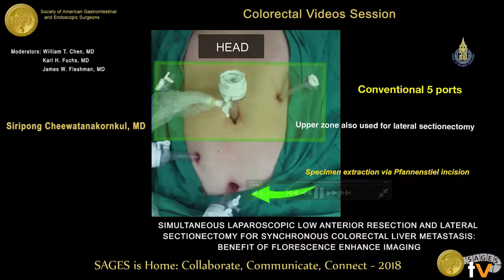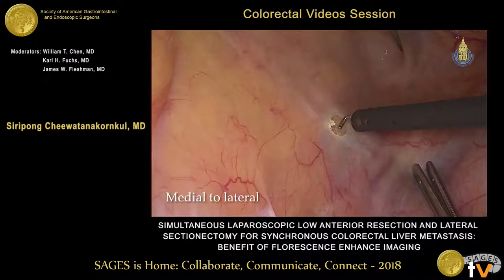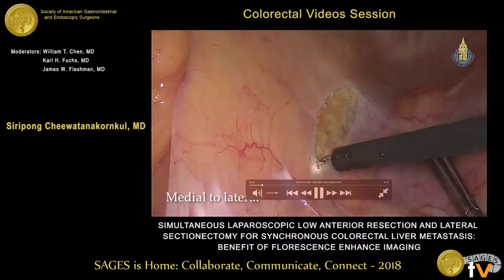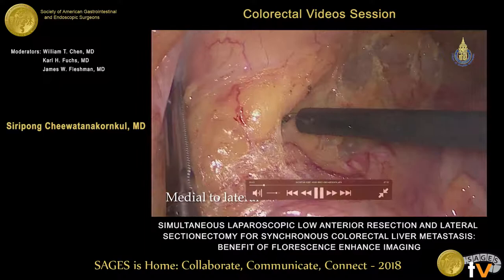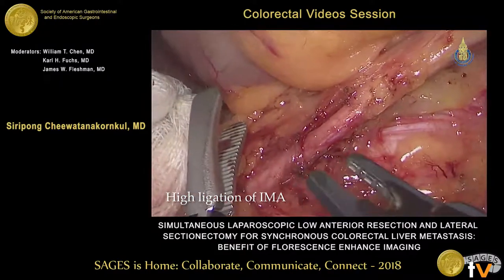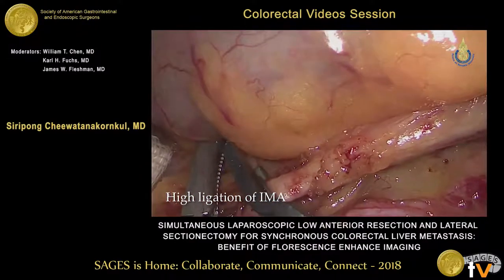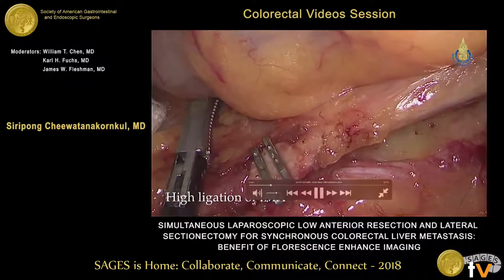We place the ports like a conventional approach — we use 5 or 6 ports like a conventional colectomy — and we begin dissection in a medial-to-lateral fashion. We follow the superior rectal artery to the root of the IMA. Most of the time, we prefer to do a skeletonized IMA like this, and then perform a high ligation. Except in cases with severe arterial sclerosis or severely debilitating patients, we do a low ligation. As you see here, you can see the nerve very clearly.